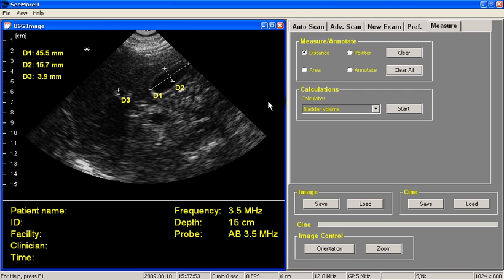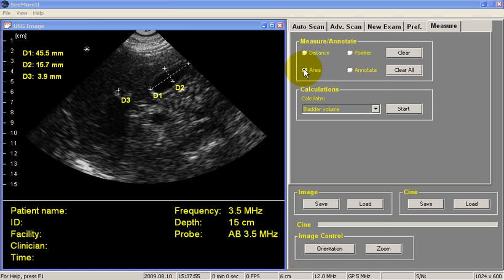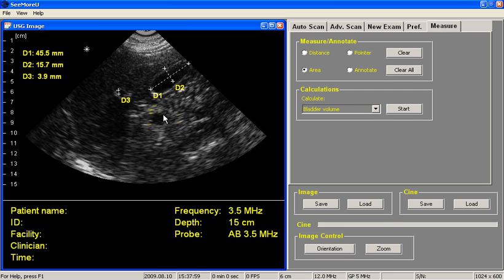Area measurements are very similar. We click on the Area button, move the arrow to the area we want to measure, right-click, trace the boundary, release the button, we get our area measurement, and again we can make as many area measurements as we like.